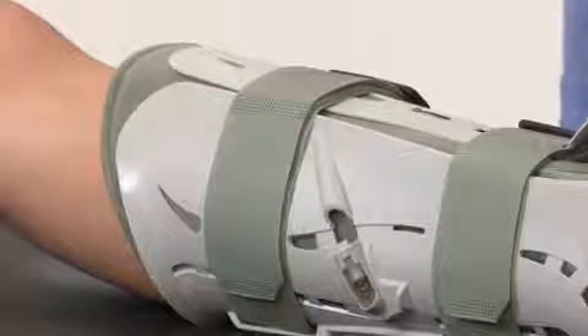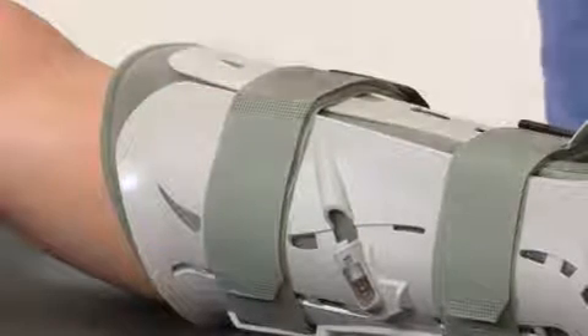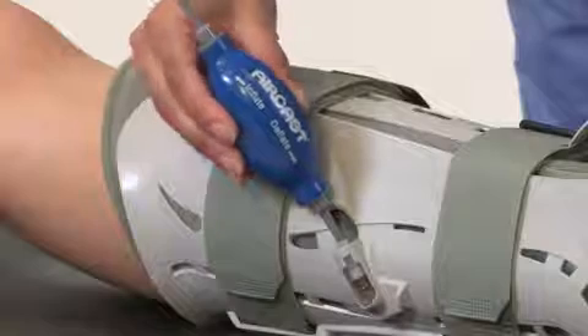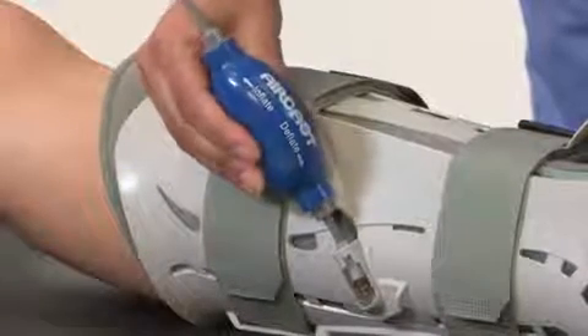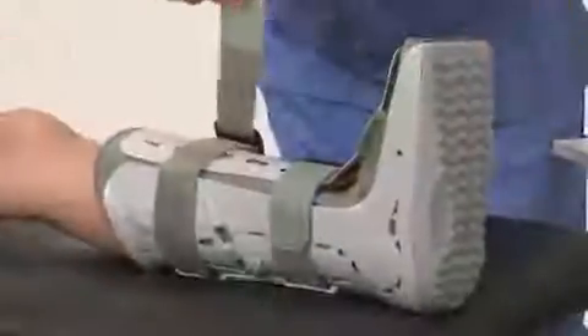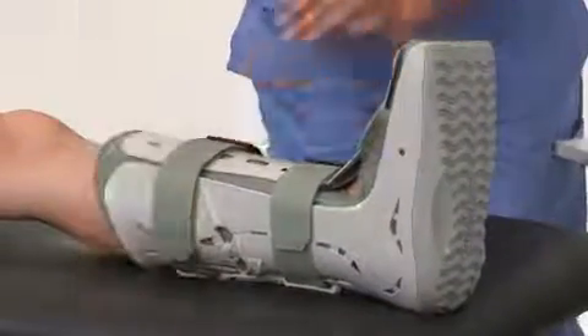If you over-inflate the air cells, simply deflate them by inserting the deflator tip of the hand bulb into the valve and squeezing until you've found a comfortable pressure. You can also adjust the pressure by tightening or loosening the straps.